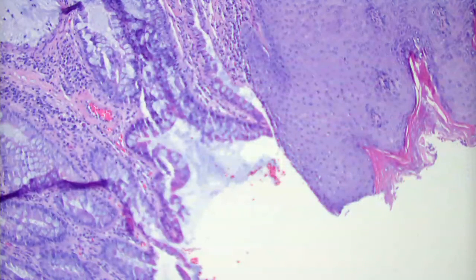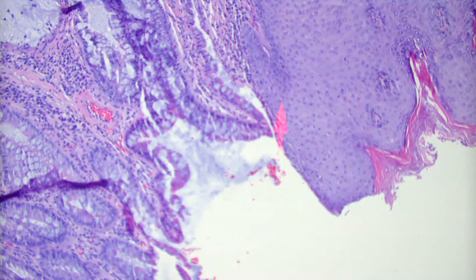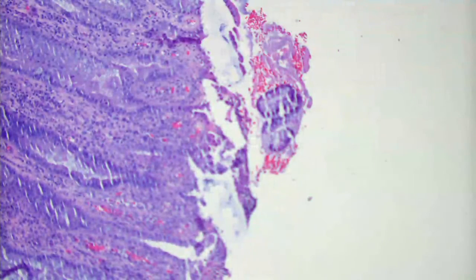And so here you can see the normal squamous epithelium, and then right here, a nice transition zone between the gastrointestinal epithelium and the squamous epithelium. And this is eroded over here, and this is doing its job, producing a cornified layer. So this is basically what it looks like clinically. These little papules like this, they're usually kind of glistening and kind of irritated.